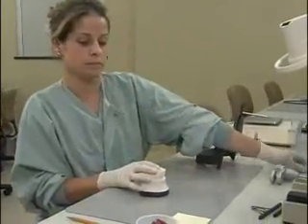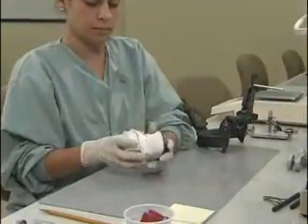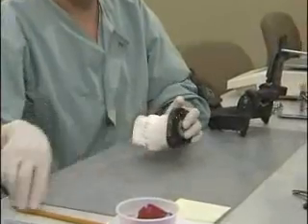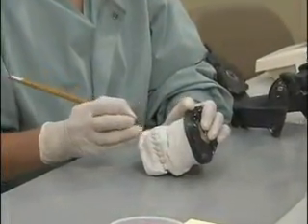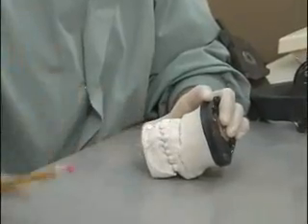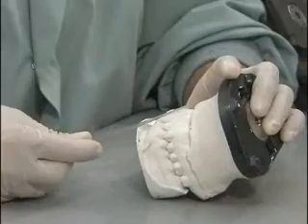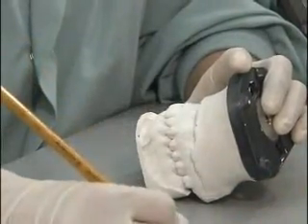Place the models together at maximum intercuspation. Now mark each model with a horizontal pencil line on the gingiva adjacent to the central incisors. Measure the distance between the lines in millimeters and mark it down.